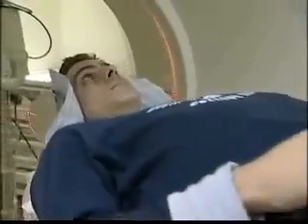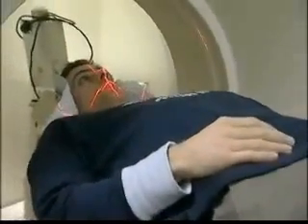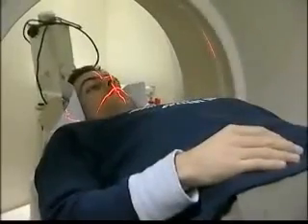Alan is now being placed in the CT scanner and the radiographer uses a laser beam to place his head in precisely the right location.